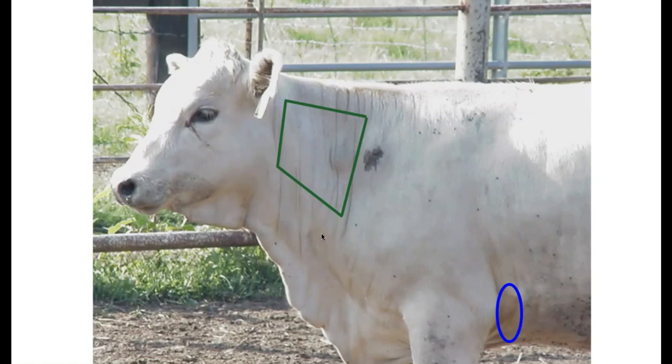I mentioned this earlier, but let's say we're giving more than one vaccine. I don't want to give one and then go down a few inches below and give another one. Give one vaccine and then 4 inches or a hand's width over, I could give another vaccine. If I needed to give a third, then go over to the other side of the animal and do that. So do make sure you space those apart and be mindful how you're spacing them.